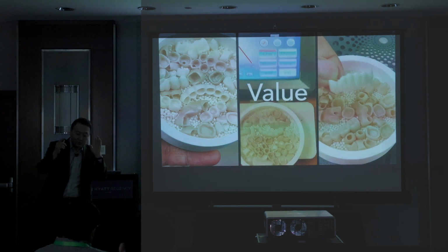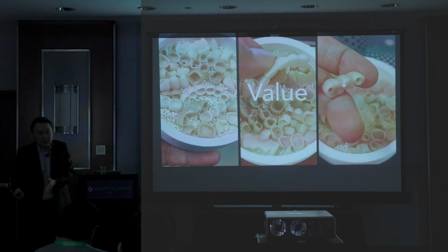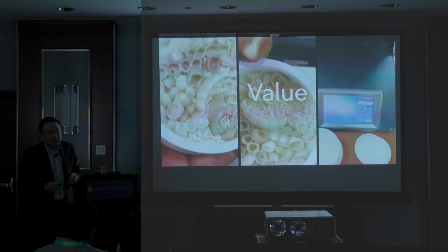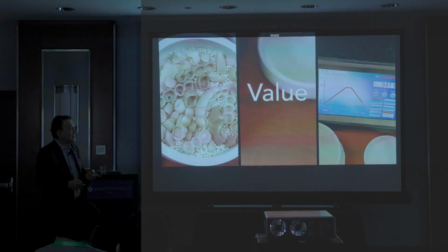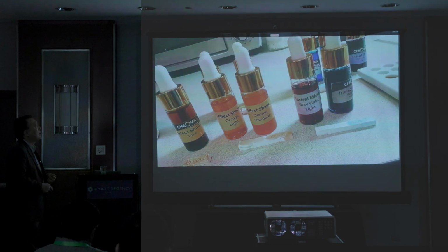After fire, looks like I'm a cook, just like a bread maker. Whenever I put it into the oven, before I do coloring or color block, you have to know the exact value you're looking for. Doesn't matter if it's monolithic, doesn't matter veneers, doesn't matter if it's layering. So that's another concept. You have to know all the story for that.